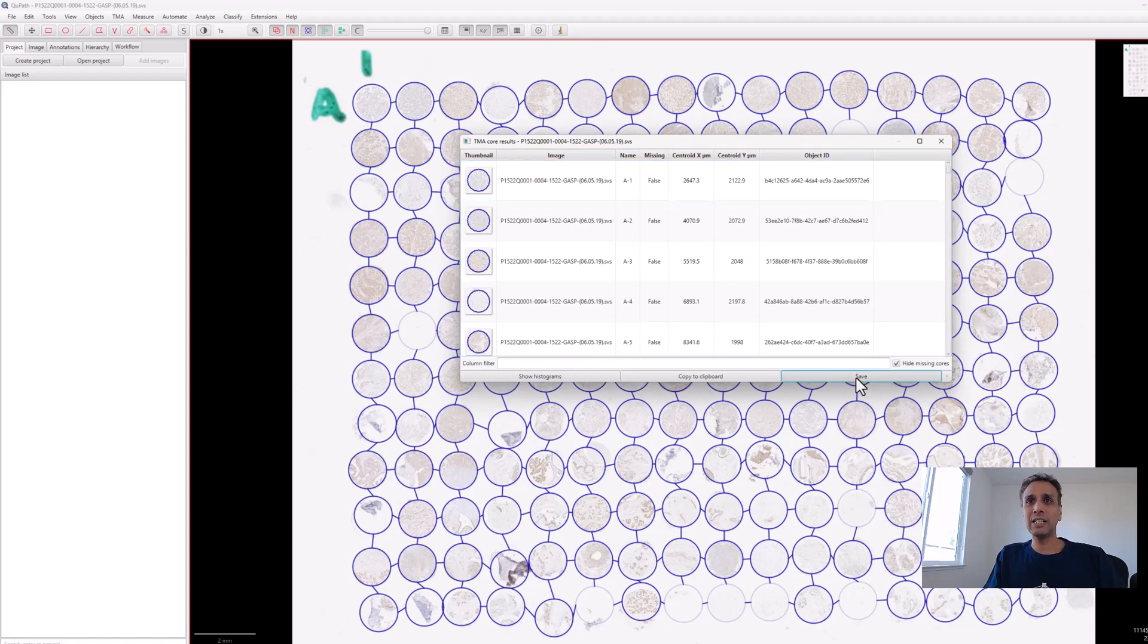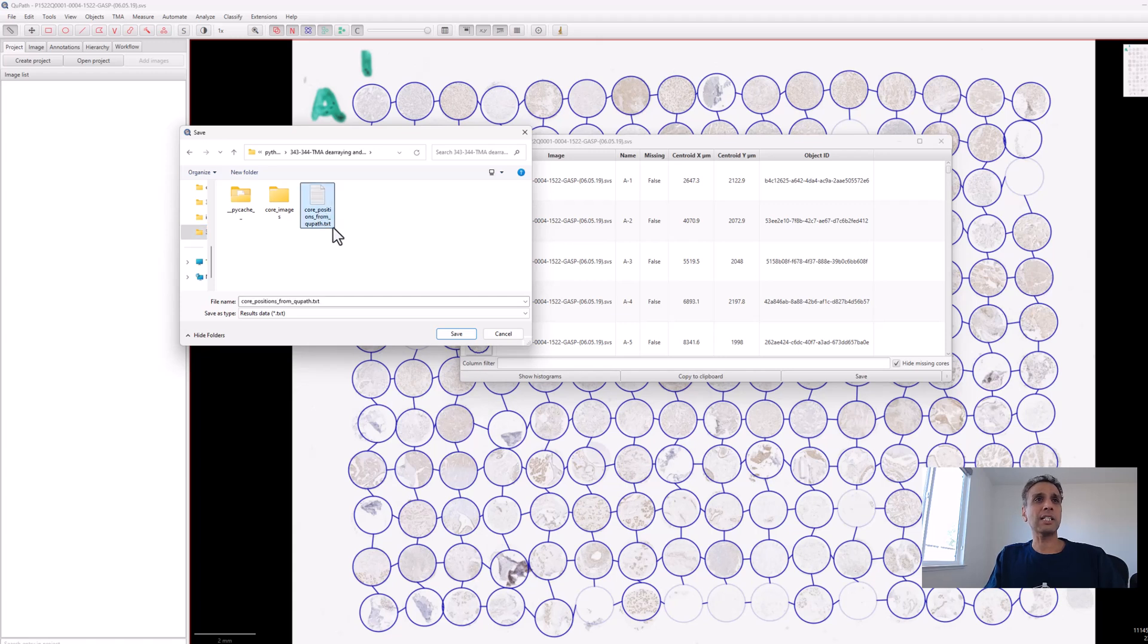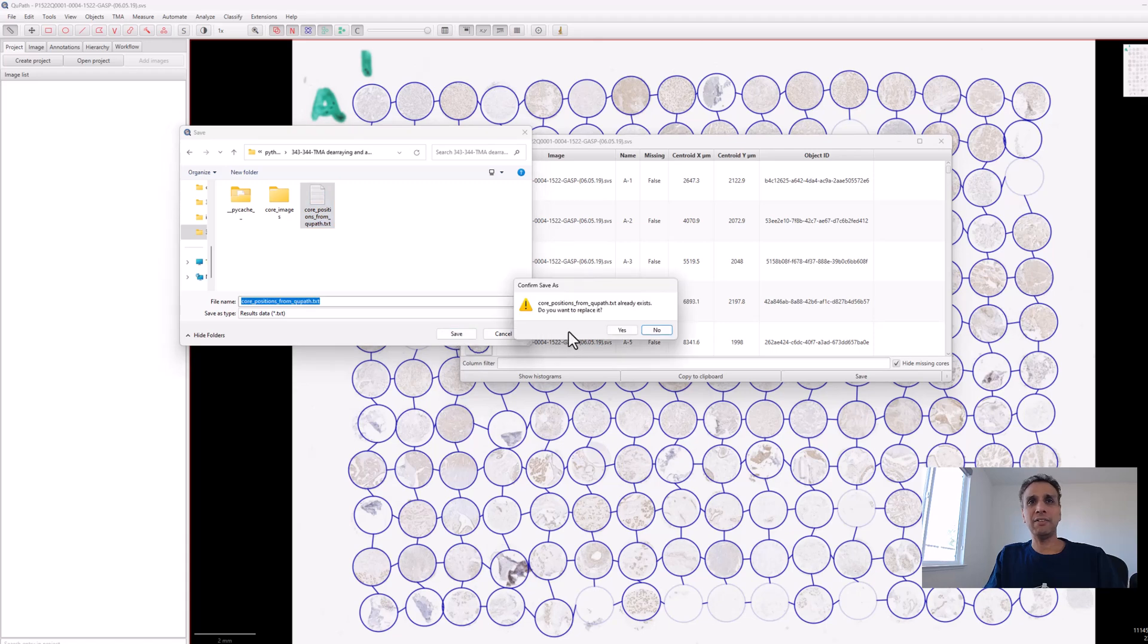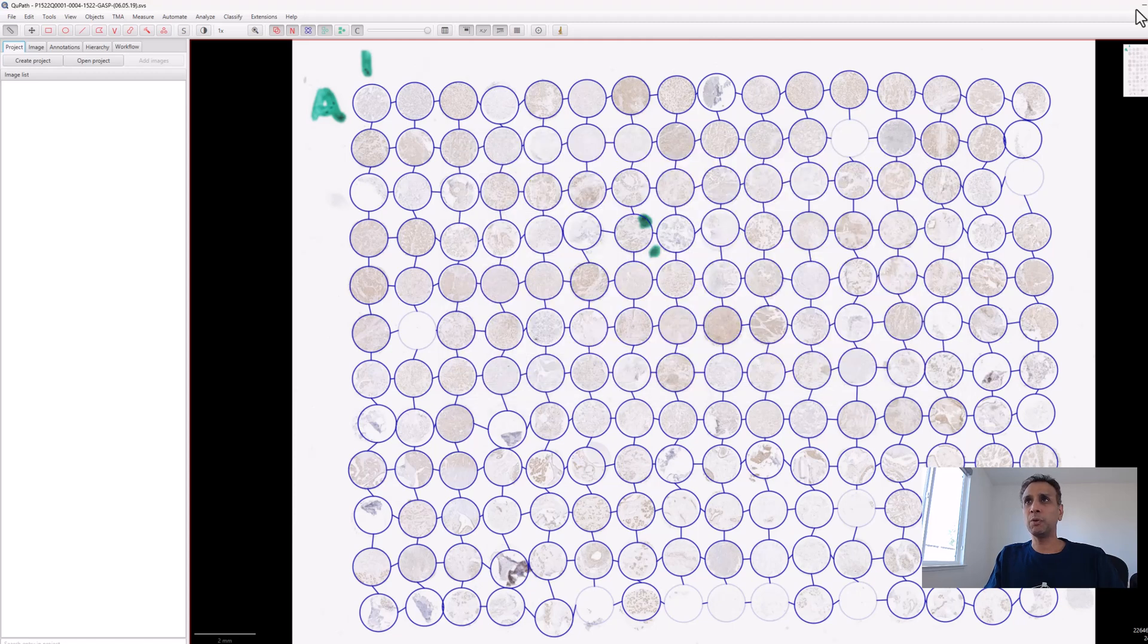Let's save this as a text file: core positions from QuPath. I'll overwrite the one I had from earlier. That's it, I don't need QuPath anymore.